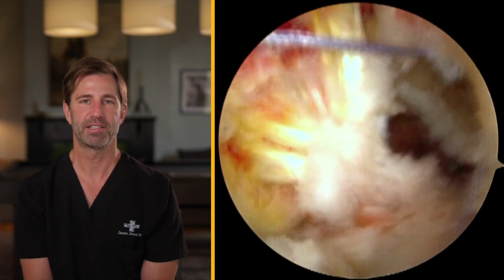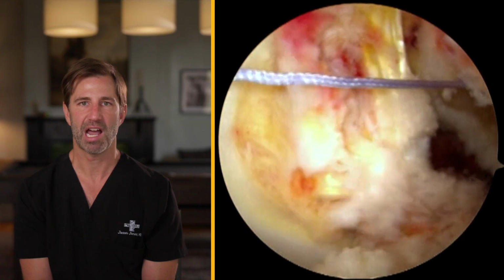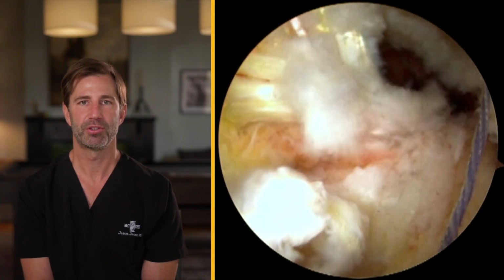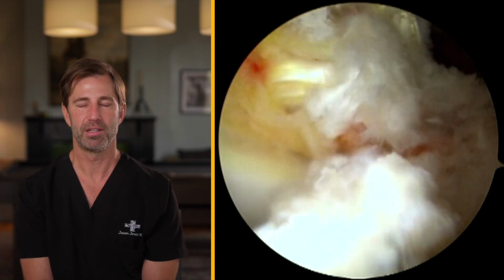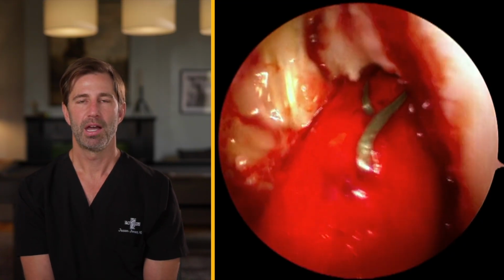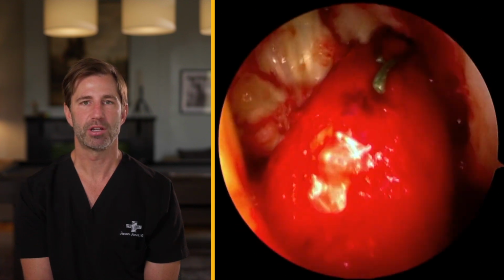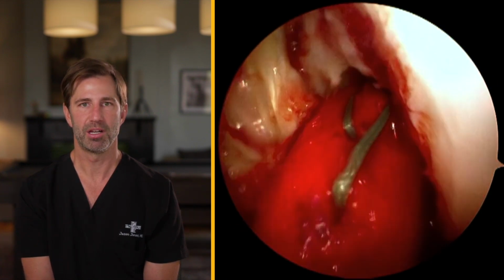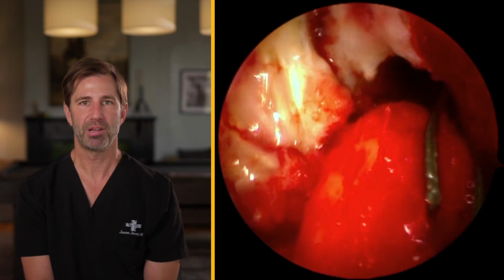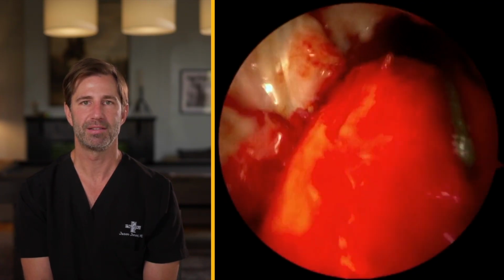And in this particular case, since we're using a bone tendon bone type of reconstruction, we have to base these new bone tunnels. The size is based off the size of the bone block from the new ligament. At this point in the case, we've established bone tunnels for both the femur and the tibia, and we're pulling the new bone tendon bone construct into place. This will be the patient's new ACL.